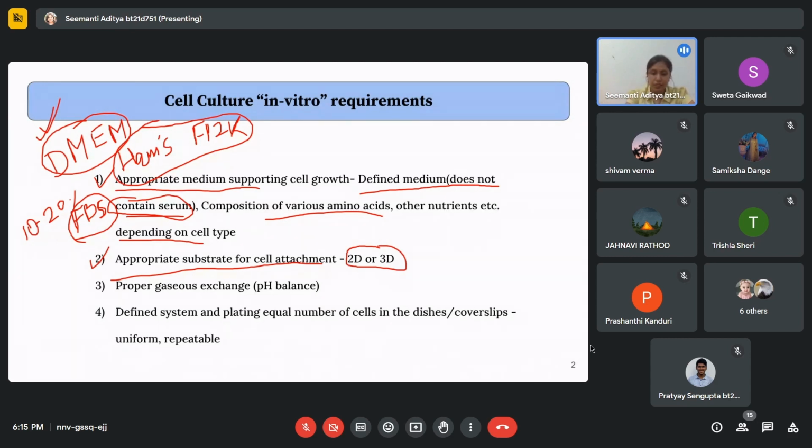3D cell culture is a little bit different from 2D cell culture. It is different in the sense that when you are observing cells seeded in a 3D environment under a microscope, it might be a little difficult to focus, and we might require good microscope characteristics, like Z stacking, to see the proper morphology of the cells. So depending upon your requirement, if we want to test a particular chemical or a particular drug and it needs to be more relevant, then 3D cell culture becomes important.